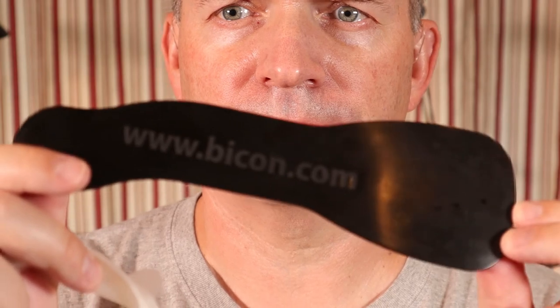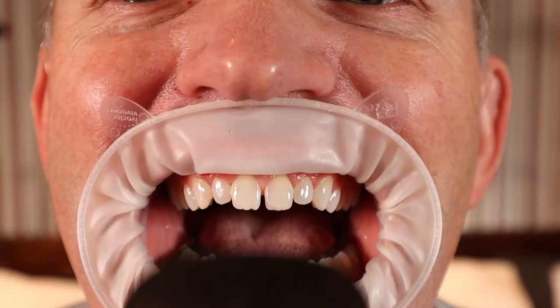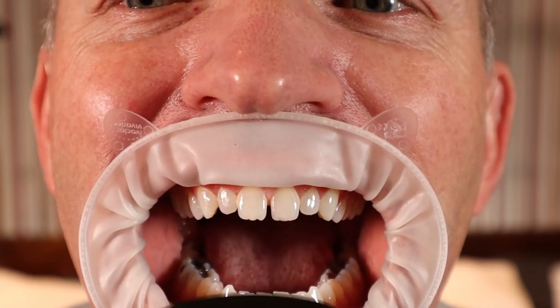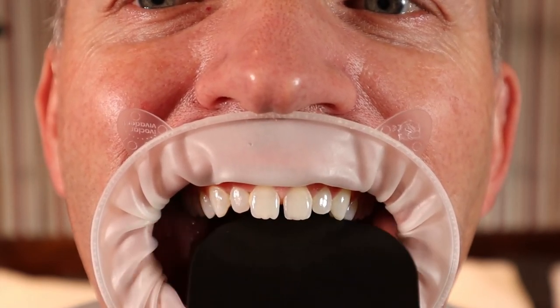I actually can't even remember the last time I used one. This black piece of plastic came with an implant kit I bought. The idea behind it is when you are taking a close-up photo of a tooth for color purposes, you place this behind the tooth so it blocks out the tongue and the tooth will pop out more.